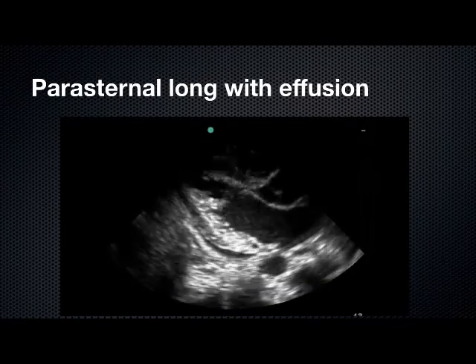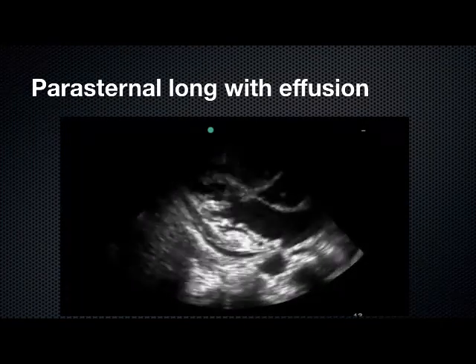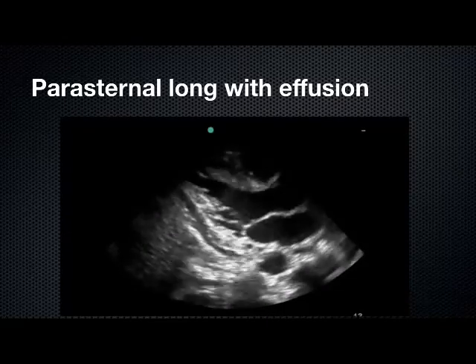And then looking at a different view of the heart, there's actually a tiny amount of fluid on the back side of the heart, just that little black stripe.